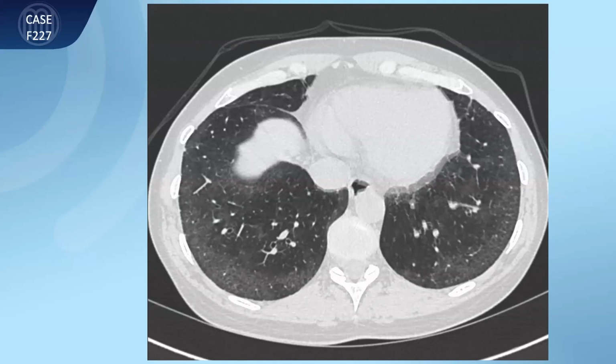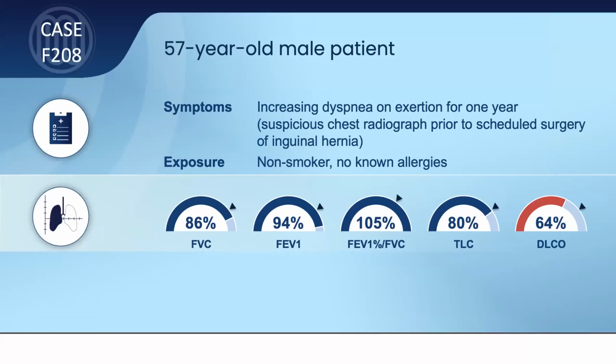Okay, I think as so many of you asked the question in regard to organizing pneumonia, I skip. Wait, before I do that, let's get to this case here, 2 more cases. And I think then we have much more to discuss.